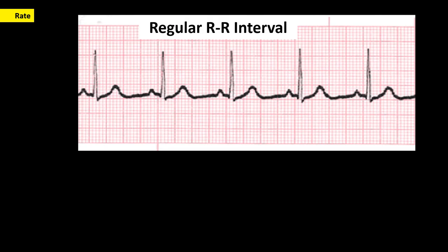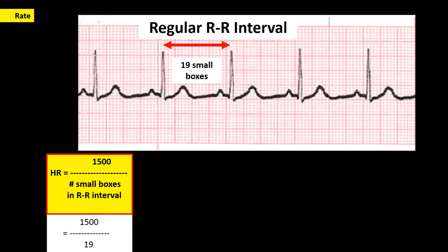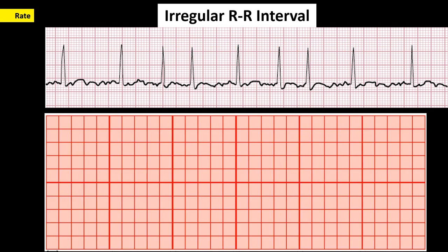For a regular R to R interval, count the number of small boxes in the R to R interval. Then use the formula: heart rate equals 1500 divided by the number of small boxes in the R to R interval. In this ECG tracing, there are 19 small boxes. So using the formula, 1500 divided by 19, the heart rate is 79 beats per minute. We learned earlier that one small box is 0.04 seconds, so one big box is 0.2 seconds, five big boxes is one second, and 30 big boxes equals 6 seconds.